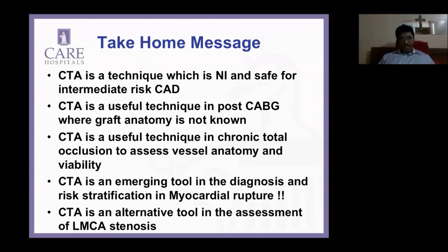Yes. So the visibility, non-visibility, collaterals, no collaterals, to me, at least with now 10 years of experience, is really not an issue, because you can get all variations of viability. Whether the distal vessel is seen or not, as Sharad pointed out, we have had a number of patients with ostioproximal occlusion where the angio shows a flush occlusion, you do a CT, and you get a fairly nice distal vessel visualization. So an angio not showing the distal vessel has no relation with viability. I've seen all variants of it.